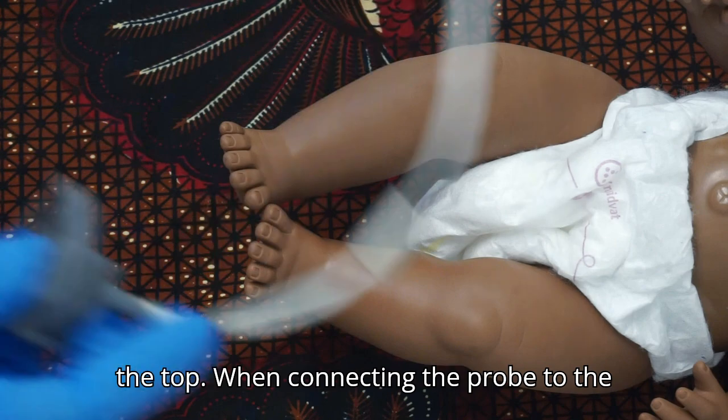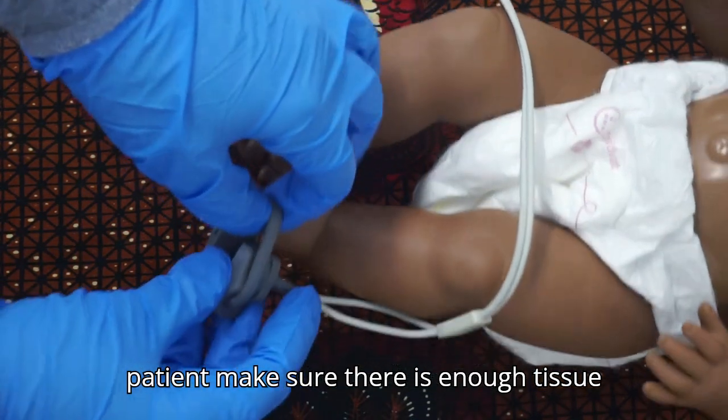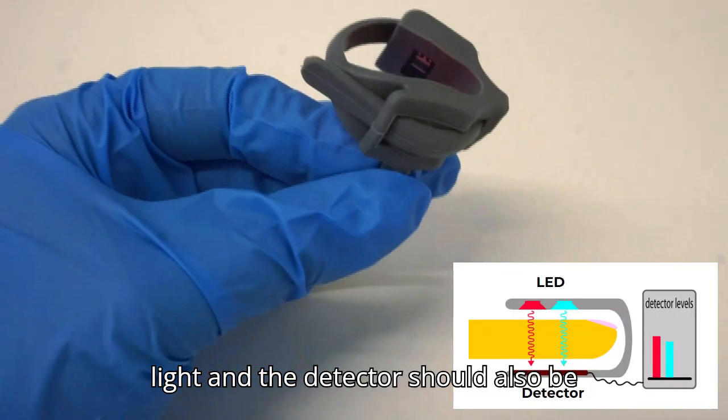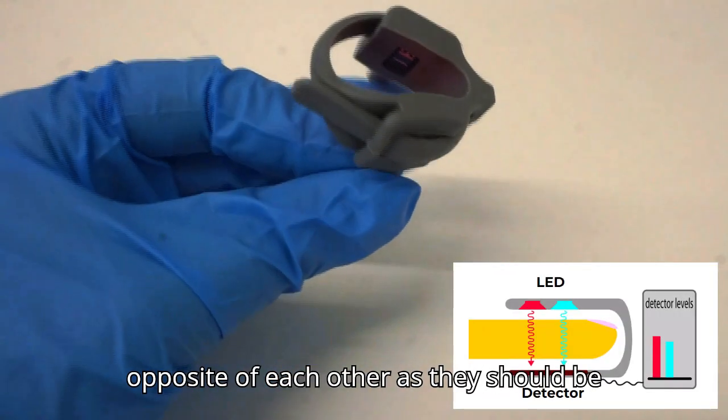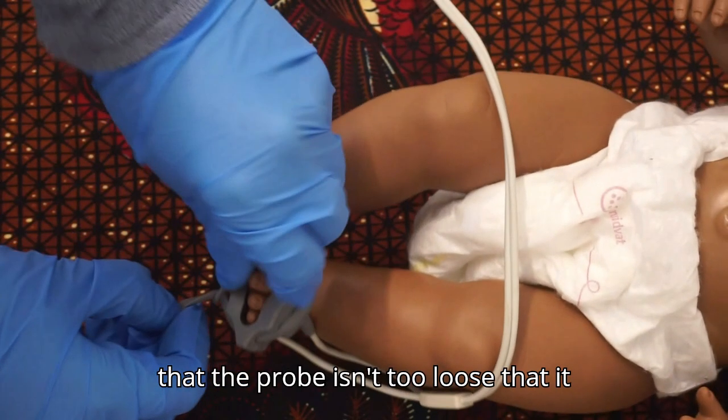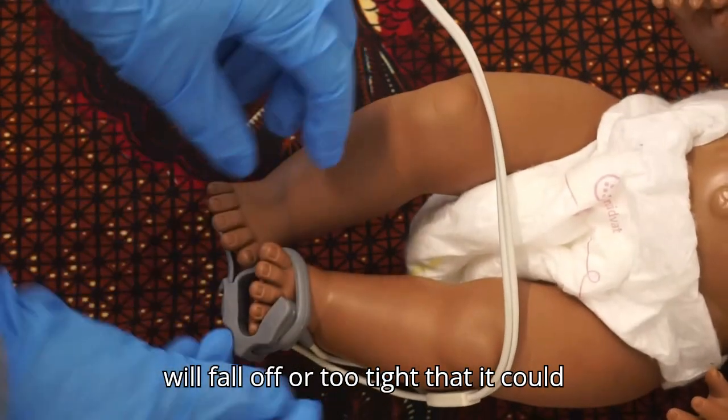When connecting the probe to the patient, make sure there is enough tissue between the light and the detector. The light and the detector should also be opposite of each other, as they should be able to talk to each other. Make sure that the probe isn't too loose that it will fall off or too tight that it could hurt the patient.